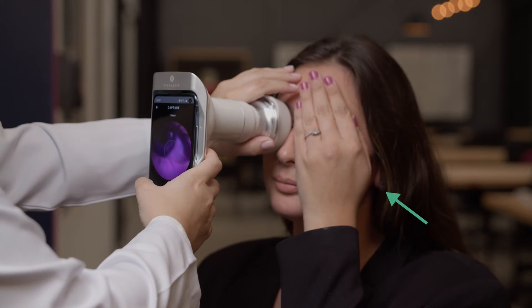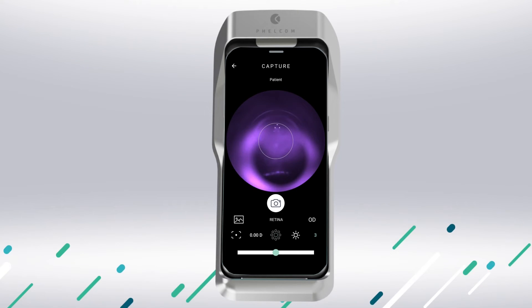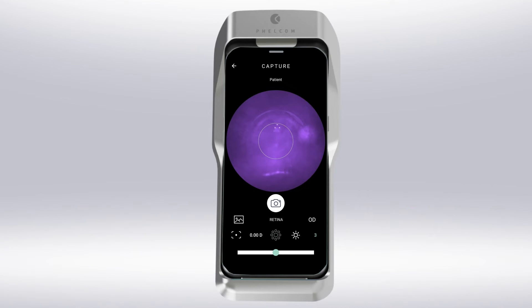Ask the patient to cover the other eye with a cupped hand. This will keep both eyes in the dark and makes it easier to focus on Ayer's internal targets. Bring Ayer closer to the patient's eye, centralizing the red reflex until the entire retina reflex is homogeneous. What you see is the patient's retina illuminated with infrared, which provides greater comfort.